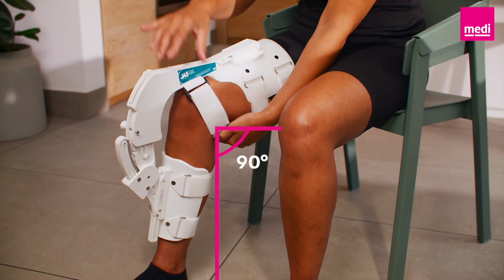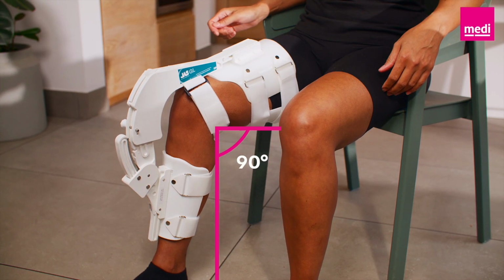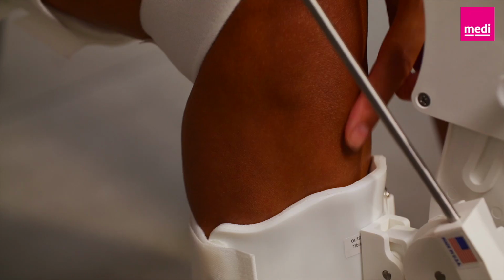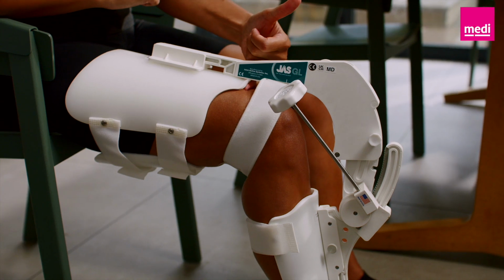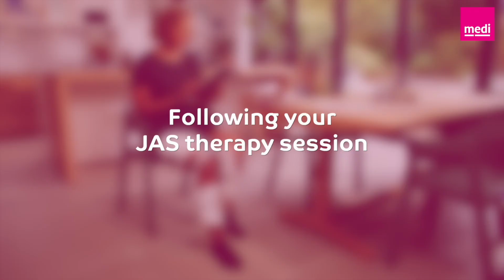If you can comfortably bend your leg more than 90 degrees, you may not need to use the knee strap. Please check you have good skin contact with no gaps between the shin and thigh cuffs while using the brace.